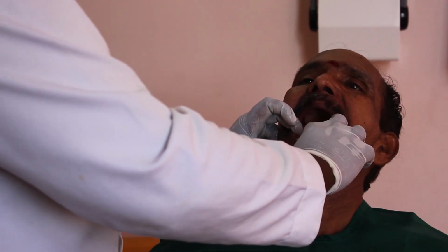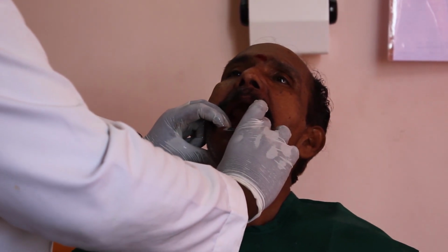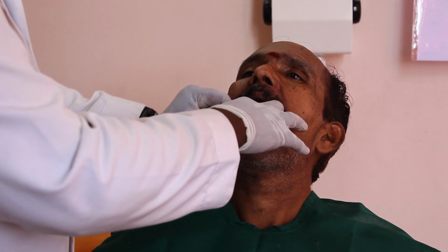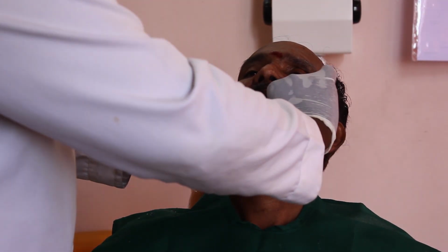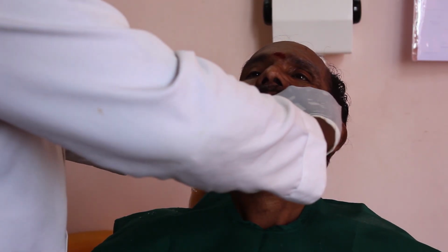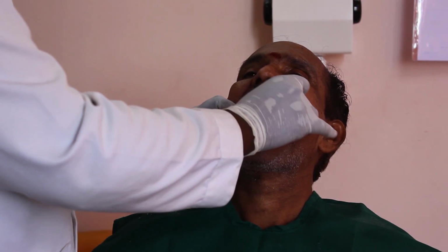Ask the patient to protrude the tongue outside. And holding the tray with one hand, you have to mold the borders of the cheeks. Similarly, hold with the other hand and then record the other side. The lingual aspect is mainly recorded by the patient's tongue movement. Ask the patient to wipe the upper lip.